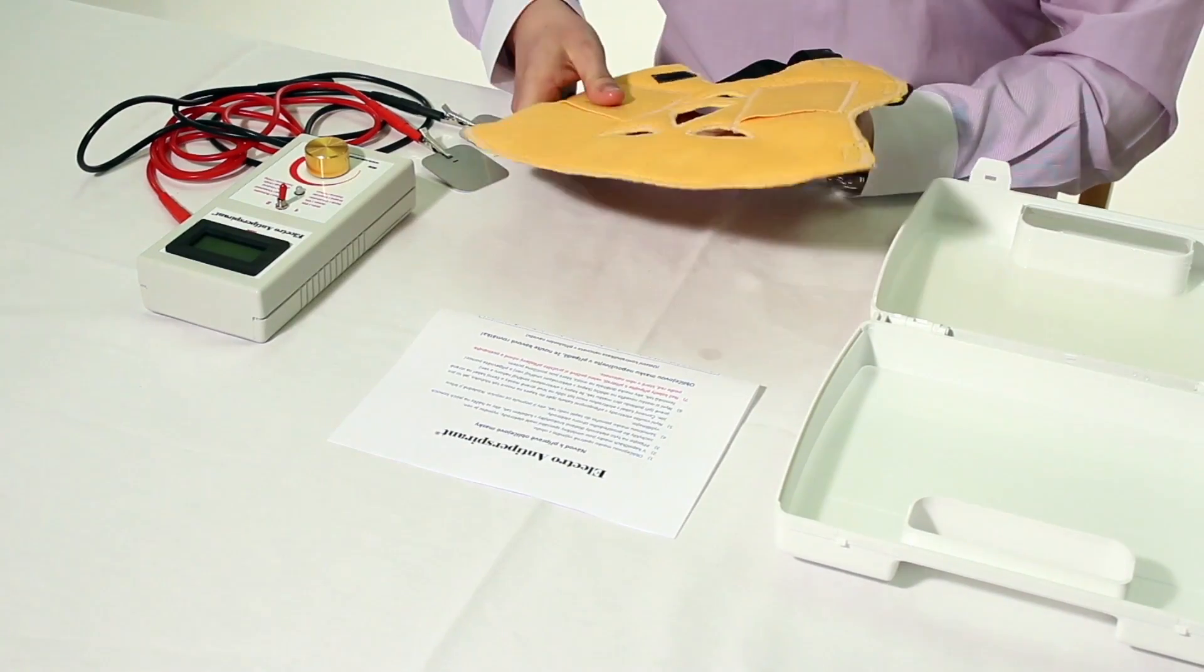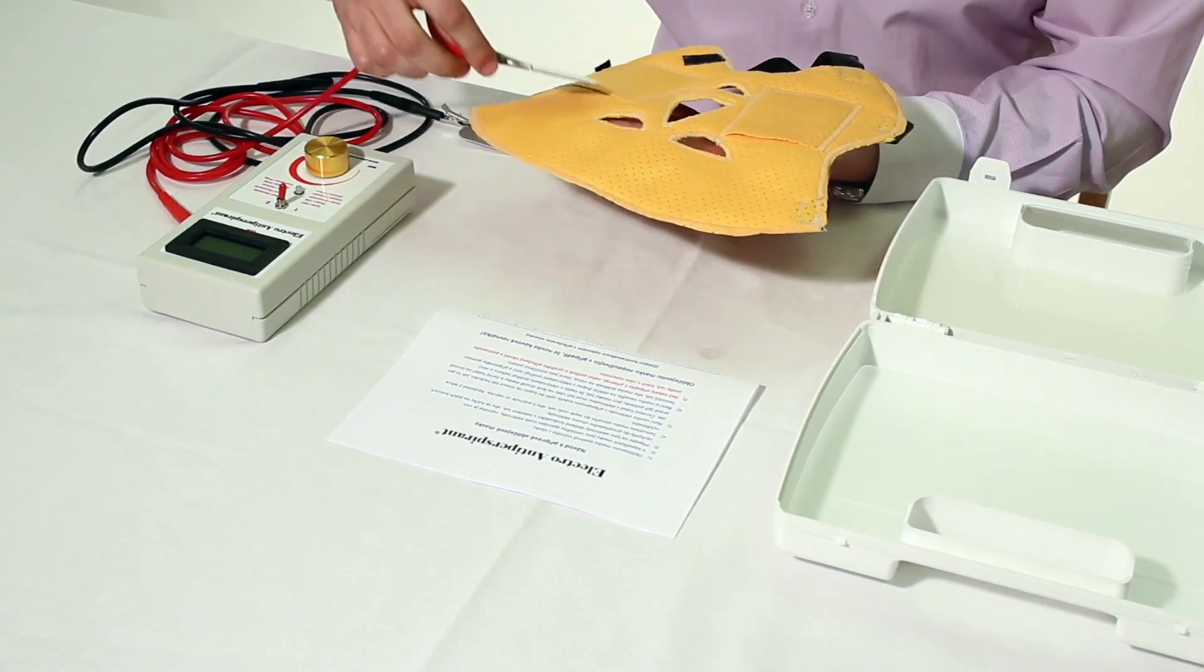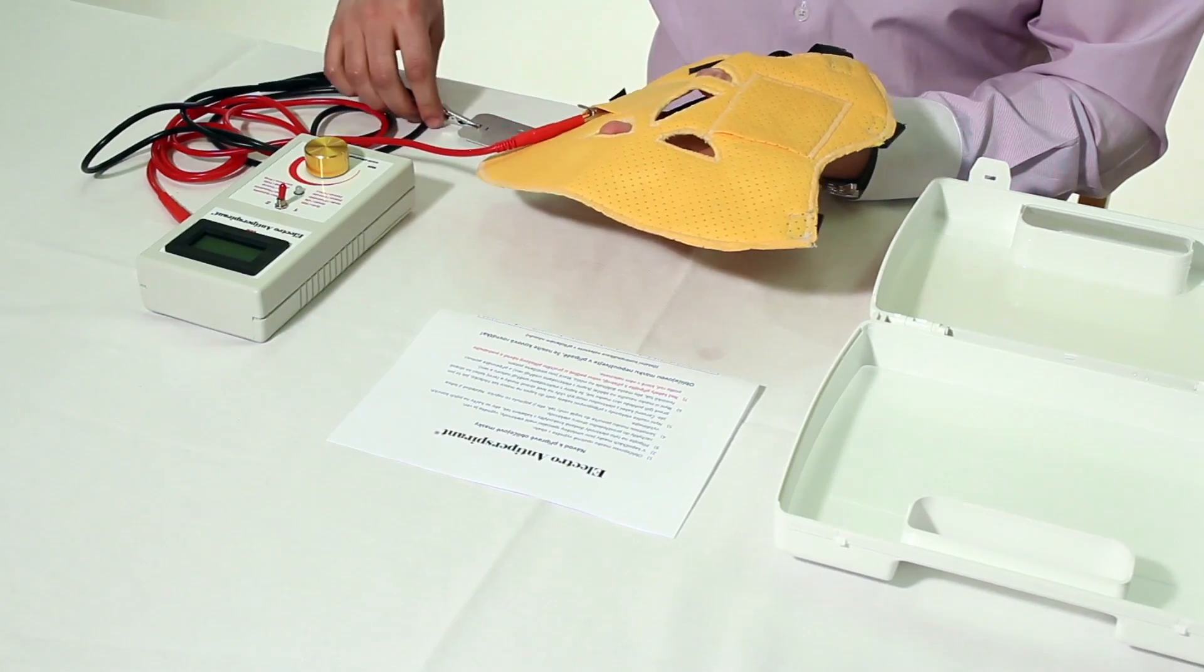Now insert the prepared electrodes along with the conductors back into the electro antiperspirant face mask as deep as it gets.